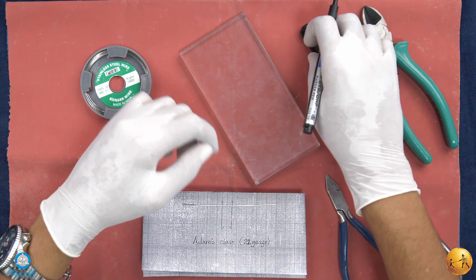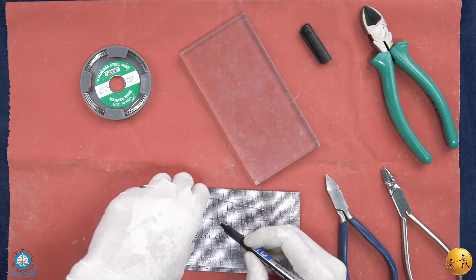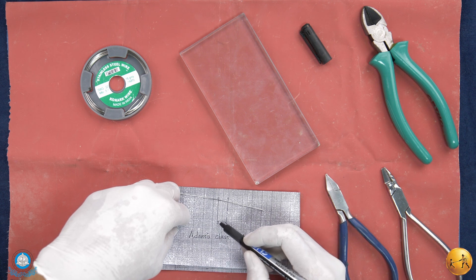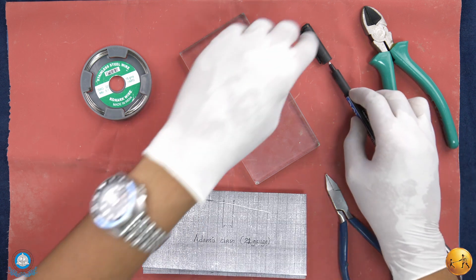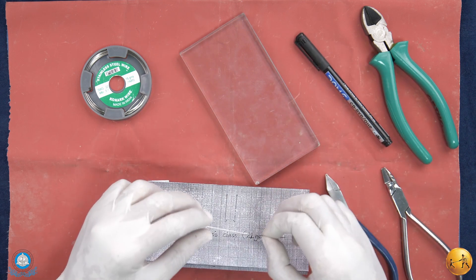The Adams clasp has two sections: a bridge in the middle of the wire bending, and two arrowheads, one on either side. The Adams clasp engages the mesio-buccal and disto-buccal undercuts.